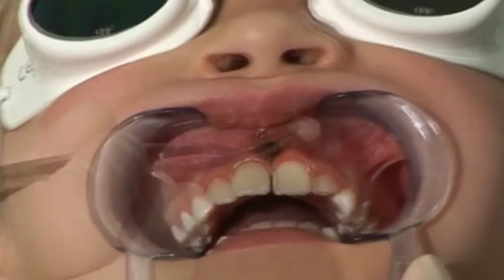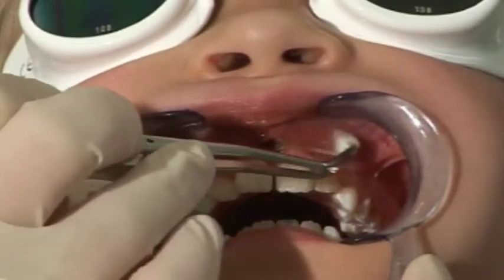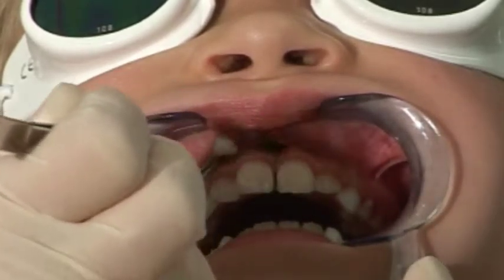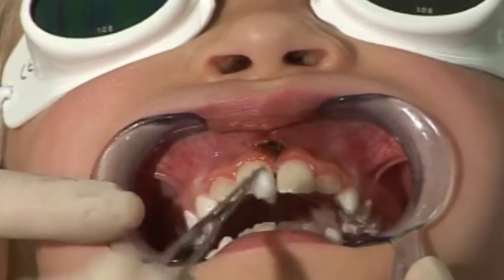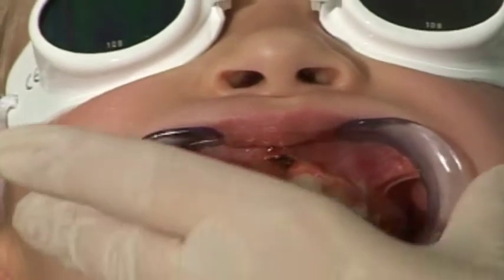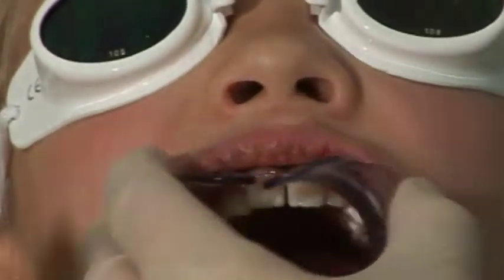In contrast to the conventional method, this treatment can be performed in a single session. Since no sutures are required, hardly any scars result. In addition, the wound is closed antibacterially and with minimal bleeding, so that functional complications are rare.